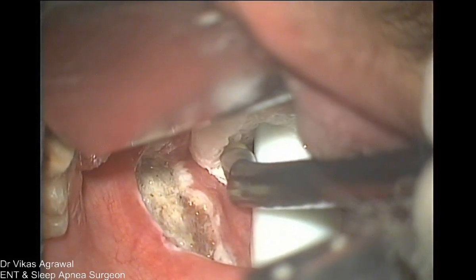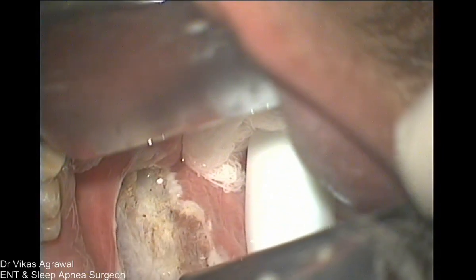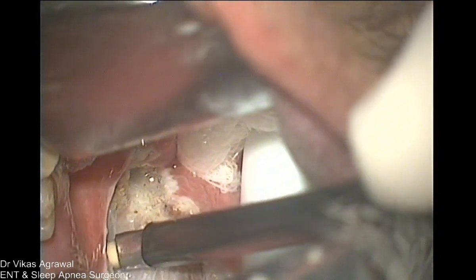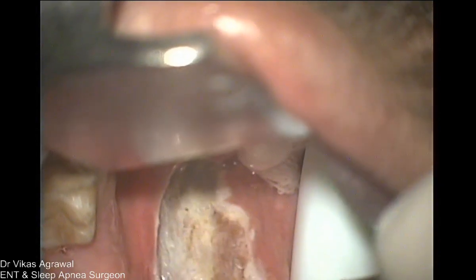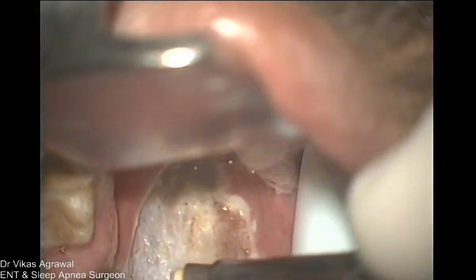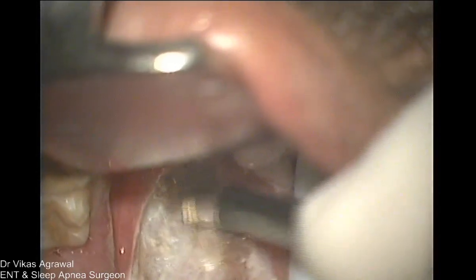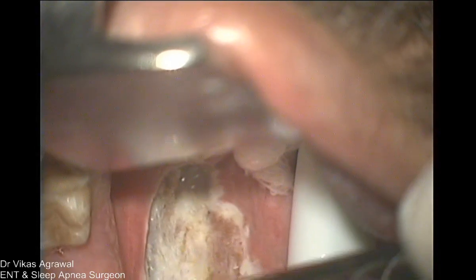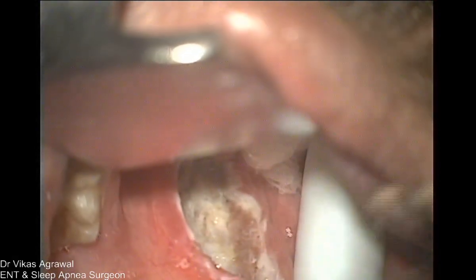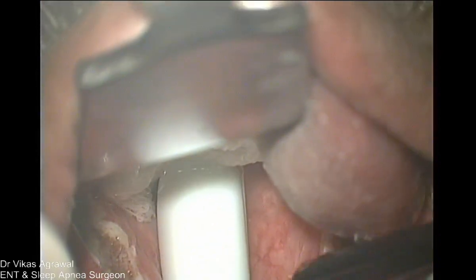So do you have to ligate the vessel anytime, or can you always control it by coagulation itself? See, initially when I was new to the technology, I did not have faith in it, and I used to ligate the superior pole. Sorry, the inferior pole. Now I do not expose the inferior pole at all. On the table, whatever is bleeding, you can coagulate with the wand. Having said that, did I ever have an opportunity to tie? Yes, I had to tie once. Not frequently. Only once. Okay, so we are done with the palatal surgery here.